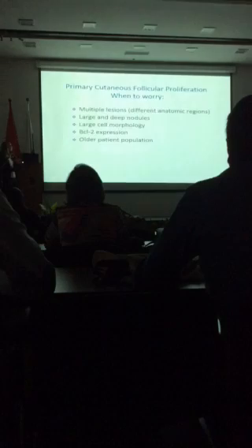So this is a patient who presented with a BCL2 expression in the infiltrate. This is another patient on the scalp presenting with a more defined plaque here at the forehead. It's very common in the elderly patient.